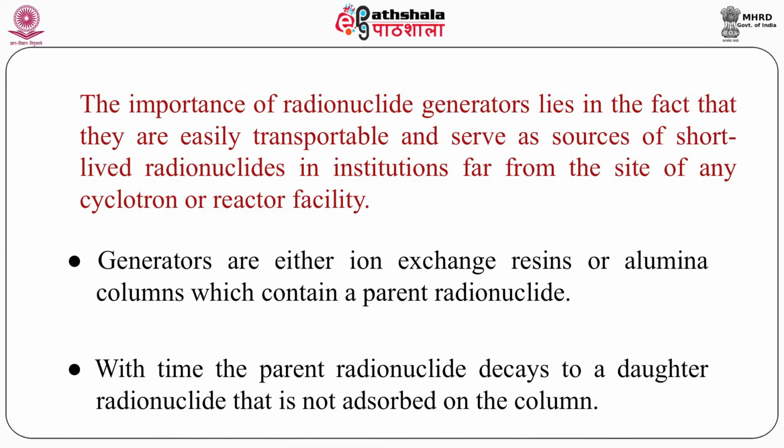The importance of radionuclide generators lies in the fact that they are easily transportable and serve as a source of short-lived radionuclides in institutions far from the site of any cyclotron or reactor facility. This is not the only generator we are talking about, molybdenum-technetium. There are other generators like germanium, gallium, strontium and yttrium that we will talk about in other slides.